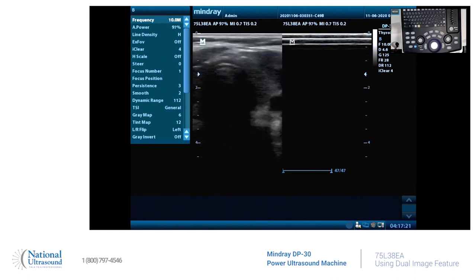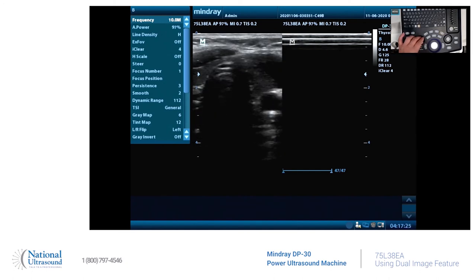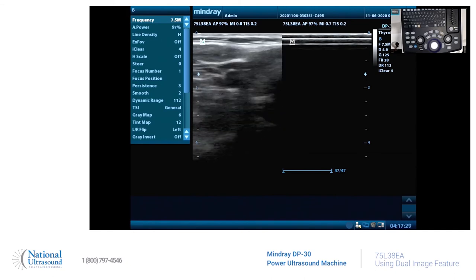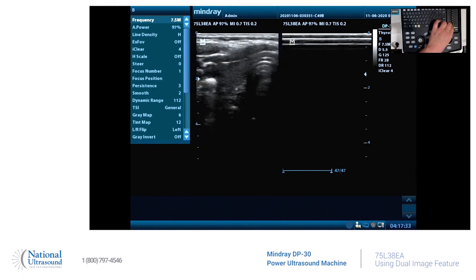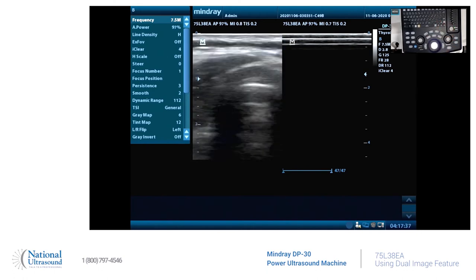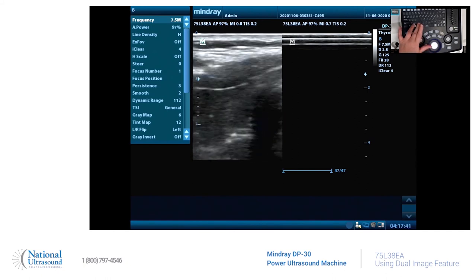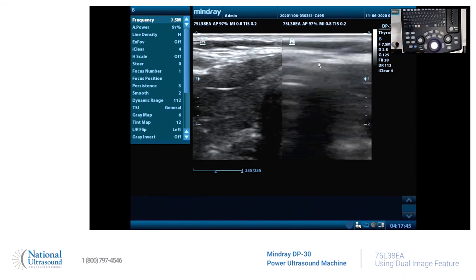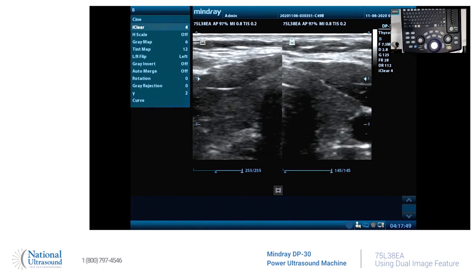Let's see if we can make a pretty thyroid on both sides. First off, I have a chunky neck, so I'm going to change the frequency down to seven and a half. And I'm going to decrease the depth so that I can zoom up on that. Here's the right side. There's the left side.